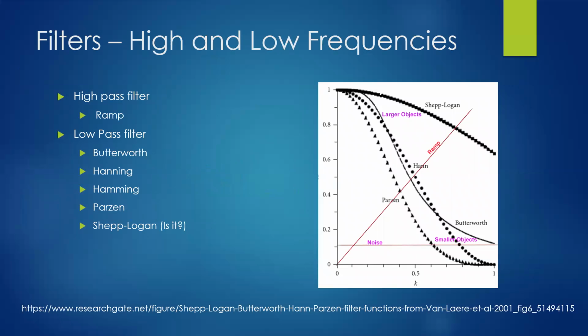Let's take a look at other filters. First of all, I wanted to give you a rendition of what these filters look like. I found this slide and I was really surprised. It shows you where the MTFs fall, and also in relationship where the cutoff is. It doesn't really, I'll take that back. It doesn't necessarily show us the MTF. It shows where the cutoffs are with the different filters, and then you could associate an MTF with that.